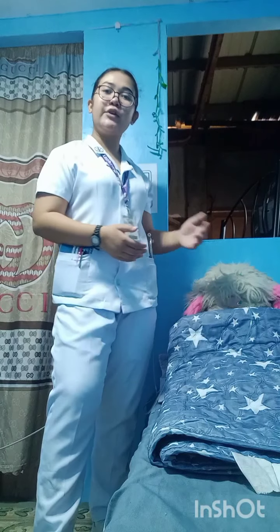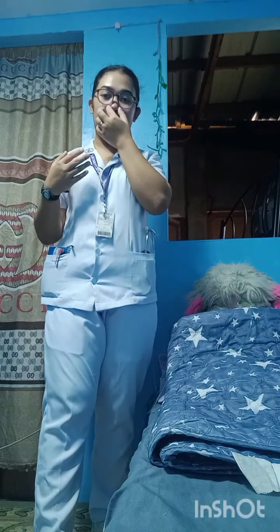Next step is we're going to do the assessment of our nasal cannula. In assessing the nasal cannula of your client, first you're going to assess your client's nares if there are any incrustation or irritation, because there are instances na yung mga client natin, lalo na yung mga hindi naglilinis ng kanilang nares or ng kanilang nostrils, meron yung mga incrustation.